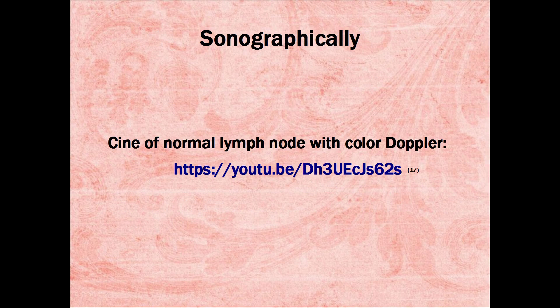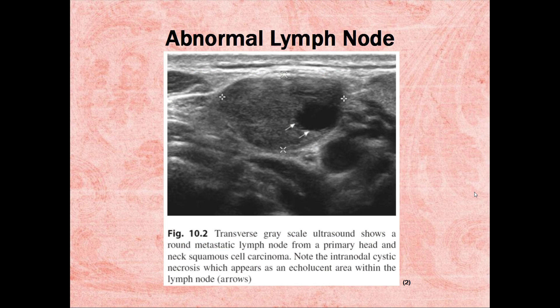Here is a link to a cine-loop of a normal lymph node with color Doppler. Here is a sonographic image of an abnormal lymph node. Transverse grayscale ultrasound shows a round metastatic lymph node from a primary head and neck squamous cell carcinoma.